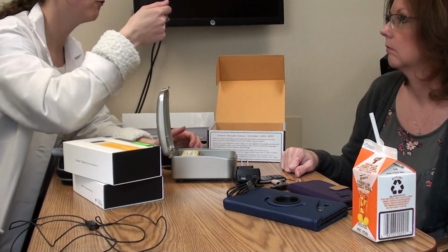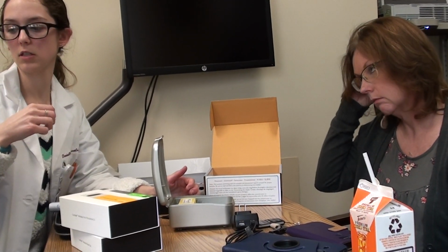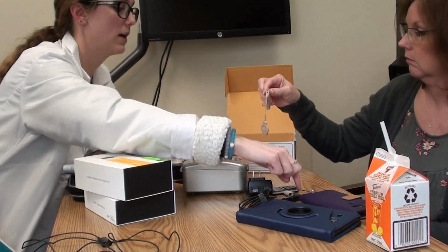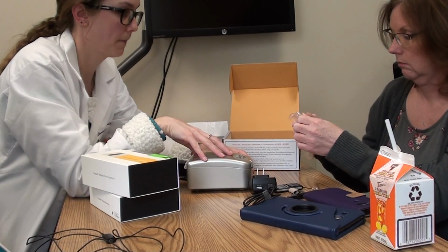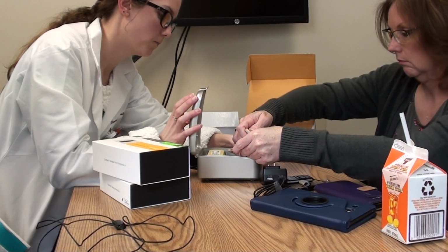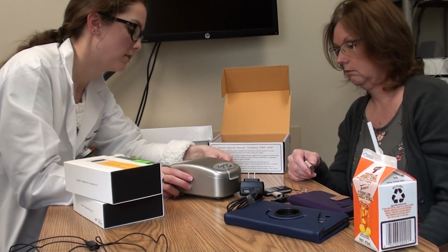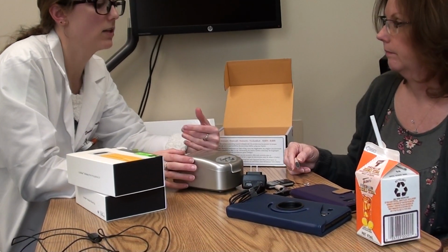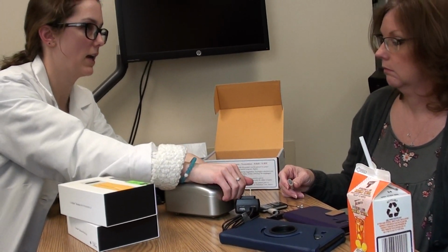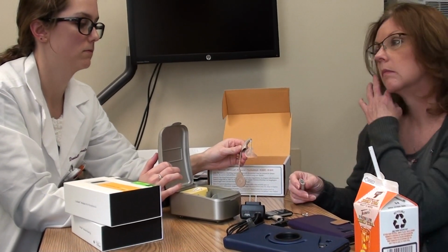You'll go ahead, take it off for me. Can she leave her ear mold in here too then? Mm-hmm. So you'll take the battery off and put it on the charger. And then you're gonna put this in here. And then you'll close it, and you'll push this button, and that'll light up green. And then in the morning, you'll take this out, put a new battery on, and then start over the next night, okay? Alternate your batteries. Okay, yeah. There you go.